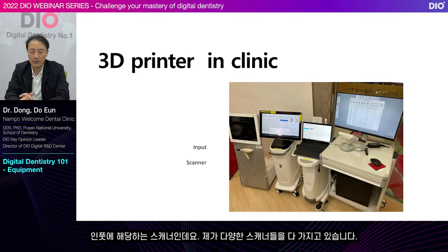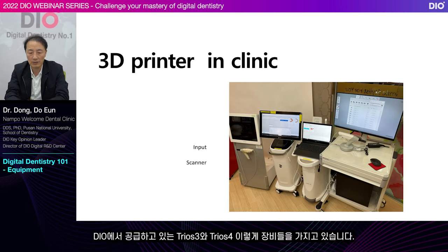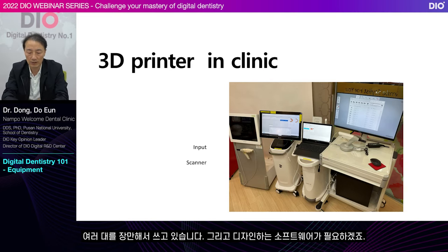This is a scanner for input. I happen to own a variety of scanners, one by one. I have a CEREC one too. I also have Trios 3 and Trios 4, supplied by Dio. If I have only one, I can't treat multiple patients at the same time. So I use multiple scanners.